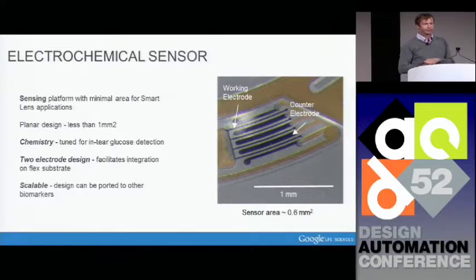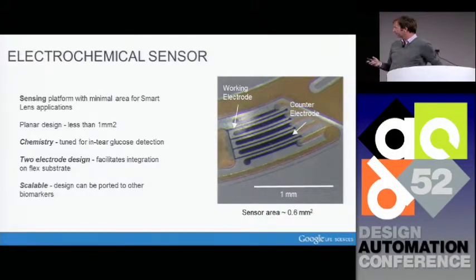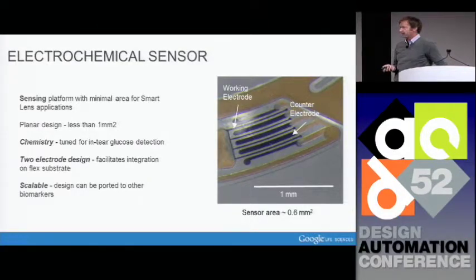And this is kind of the challenge that we put to all of the people involved in the system, is that we're going to make sure that the largest component that we're putting onto the contact lens is the SoC. Ideally, over time, the SoC will shrink as we're able to reduce feature sizes of the integrated circuit. But it would be a shame if there's a component larger than the SoC. This chip has tens of thousands of transistors on it. Hopefully it'll shrink over time. Let's make sure that everything else on the contact lens is no larger than that. And the sensor is no exception. It's a little less than a millimeter on a side, similar to the IC that's on board.